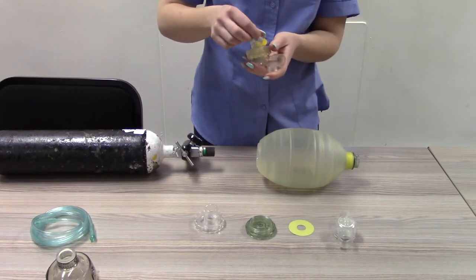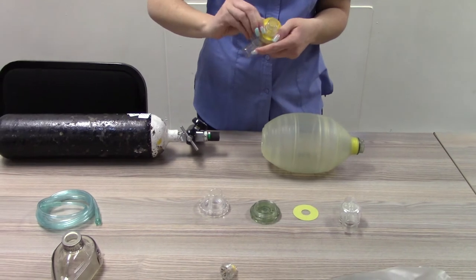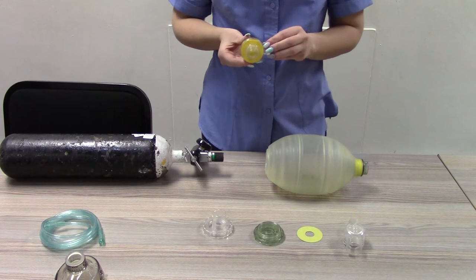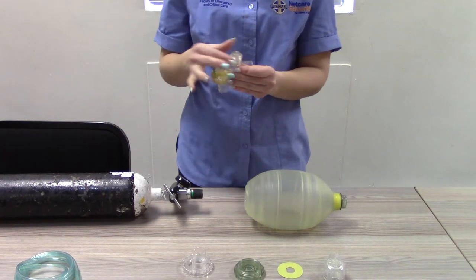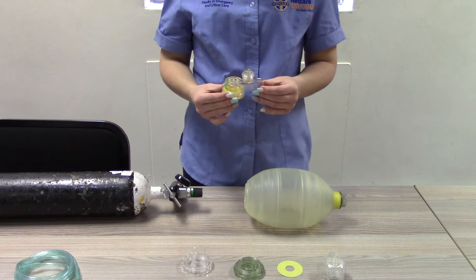Patient connected: patient non-rebreather valve. Connect the pop-off valve to the patient connector. Attach the patient connector to the ventilation bag.